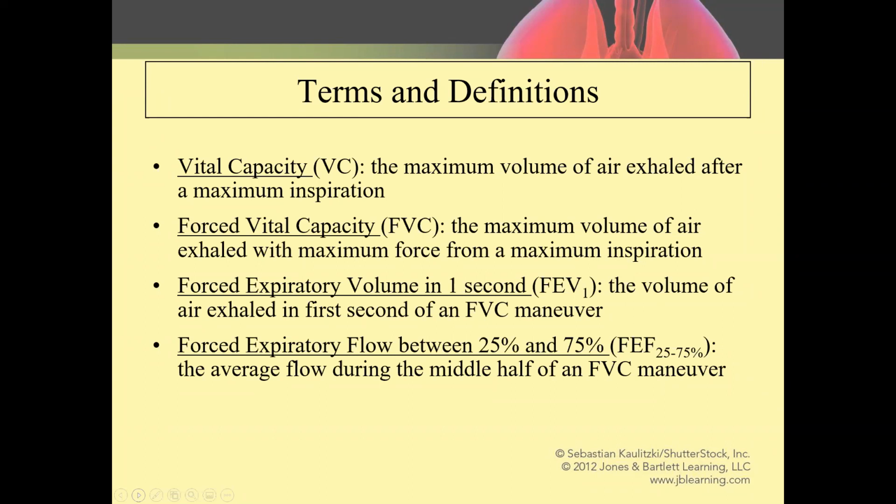Okay, the idea goes like this. In patients where the forced is much lower than the slow vital capacity, they may well have an obstructive disorder. It could be effort dependent, but assuming the efforts were both good, it can be that if you give a COPD patient enough time to exhale, it may take them 7, 8, 9, 10 seconds to exhale that vital capacity.